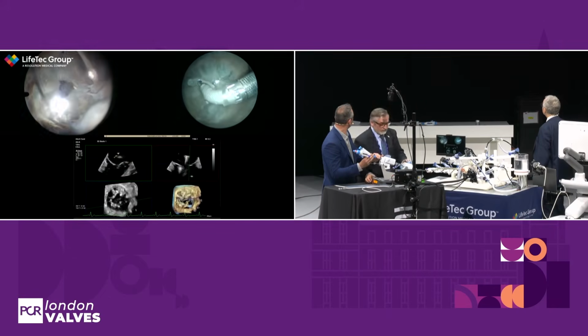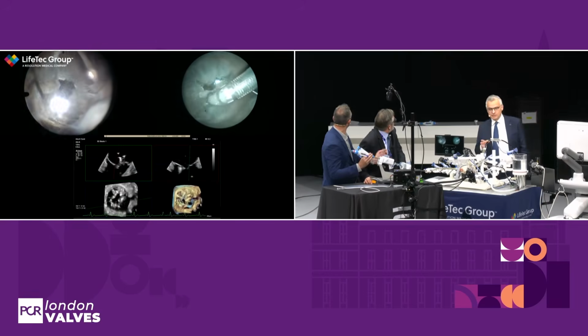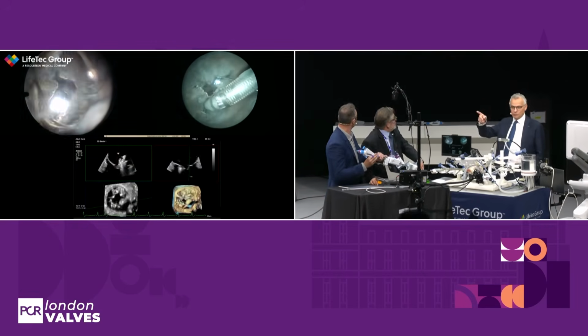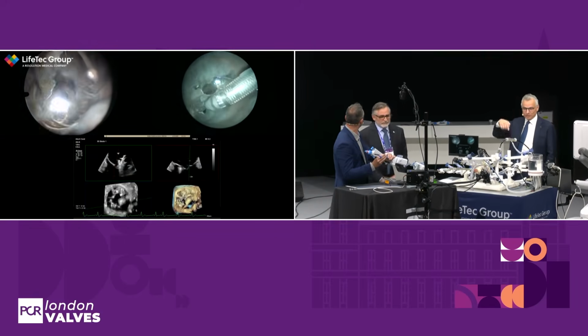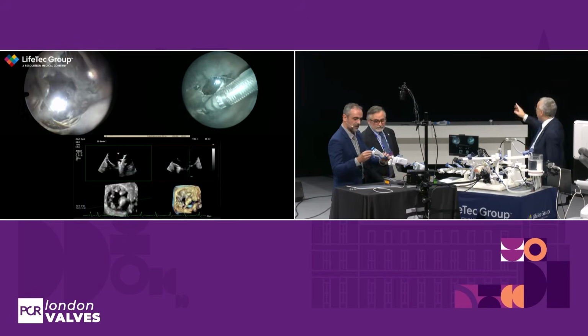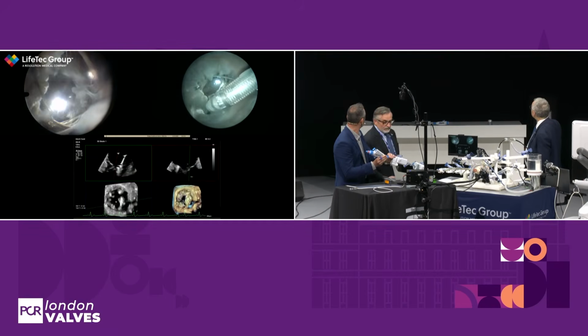Yes. And so a way to guide this procedure is to use the MPR, the opposite of what most people do, who align the MPR to the device. You align to the anatomy and to the target, and then the device has to go and somehow match. So for instance, not bad, huh?